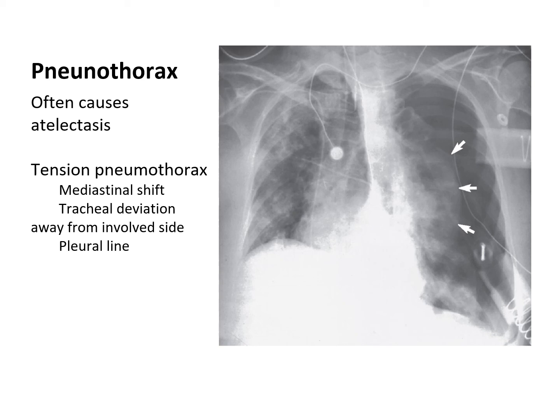Okay, so the pneumothorax here, so this is a left-sided tension pneumothorax. You can see how the pressure inside the left hemithorax has actually depressed the diaphragm there on that left side, so it doesn't have that angle. It's kind of flattened out, and it has also forced the heart to shift over more to the right side.